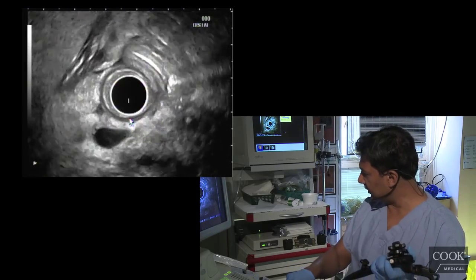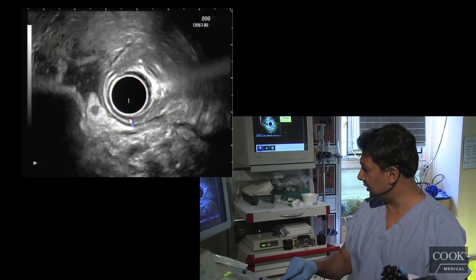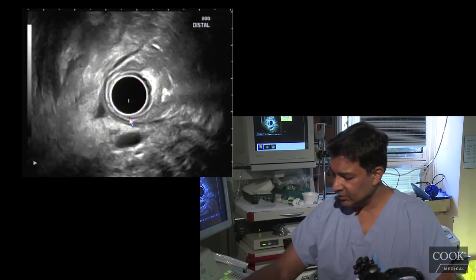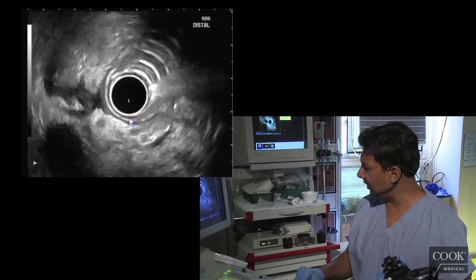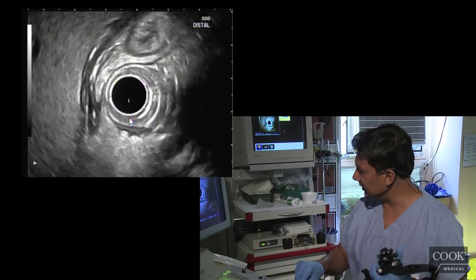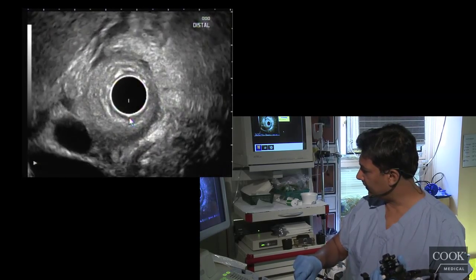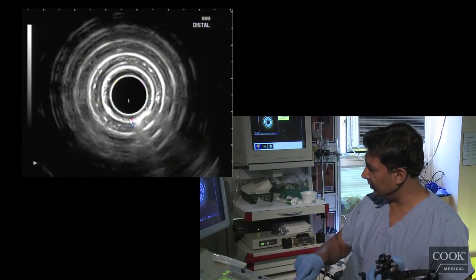I don't really see a stricture. We're right down to the papilla — looks good. People with chronic pancreatitis, in my experience, never have anything in the gallbladder. Her gallbladder should be up here somewhere; we'll look at it in a second. Putting out the balloon to keep me in the bulb, if it works.